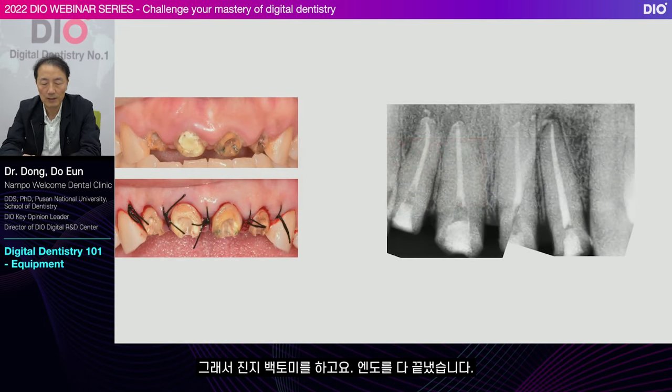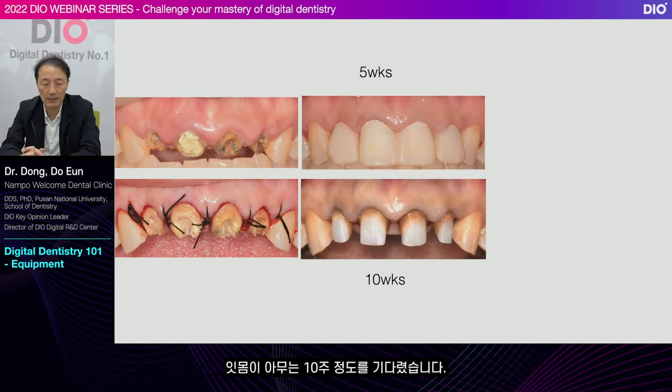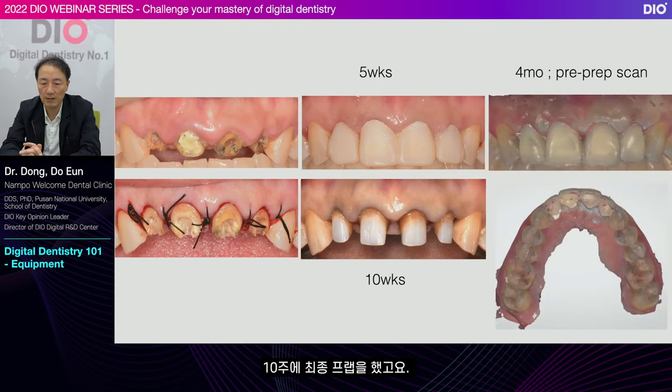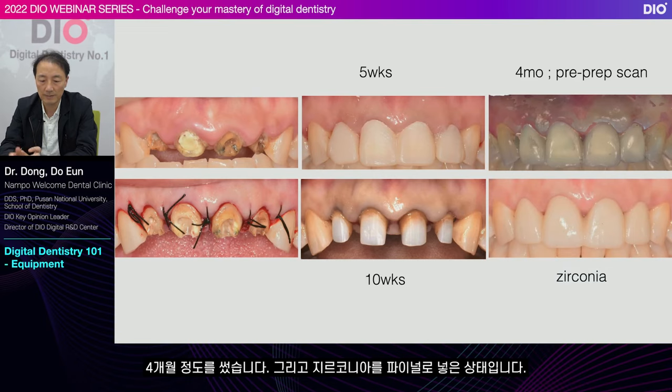Endo is finished. 5 weeks after placing the provisional, I replace this multiple times until I get the shape I want. I waited about 10 weeks for the gum to heal. The final prep was done at 10 weeks. And now, I want to transfer the shape of this final provisional. Create the occlusal points. Do you see the red dot there? Create the occlusal points and transfer this to the final prosthesis. It was used for about 4 months, and I used zirconia for the final restoration.